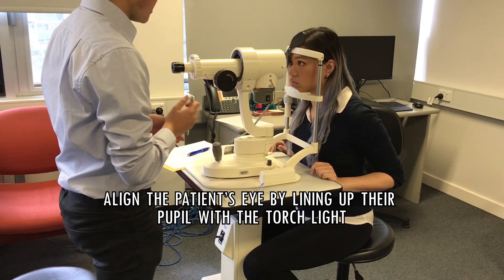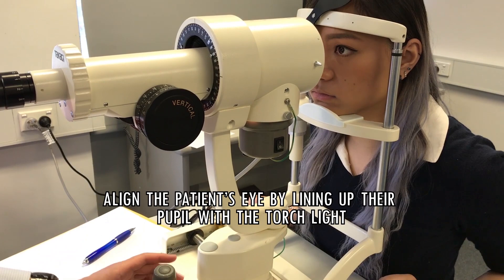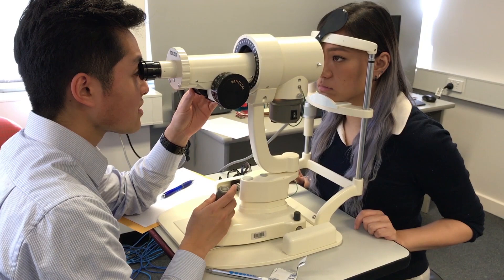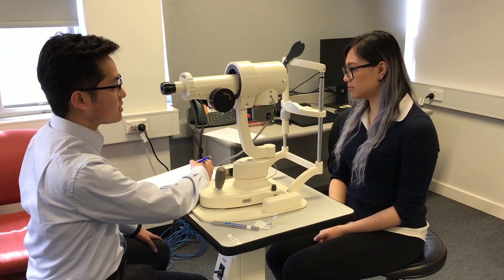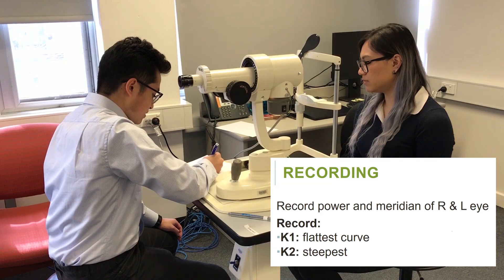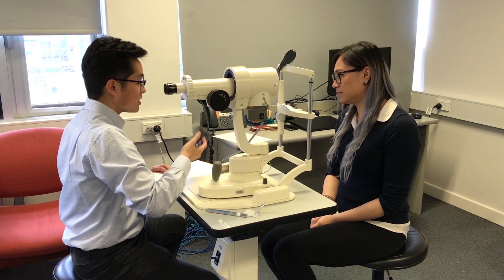I need to further light up the machine with your eye, so I'm going to shine a torch into the machine. It's going to be a bit bright but just bear with me for a second. Make sure to record the power and meridian of both eyes. Your K1 reading will be the lowest number, which represents the flattest corneal curvature, and your K2 reading will be the highest and steepest.